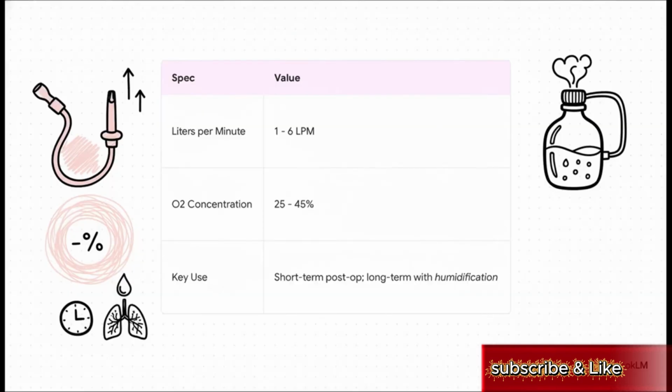Okay, let's talk numbers. A nasal cannula can deliver anywhere from 1 to 6 liters of oxygen per minute. That gives you an O2 concentration of about 25 to 45%. It's a fantastic option for short-term use, like right after surgery. But what if your patient needs it for a while? Well, that dry oxygen can get really rough on their nose. So what do we do? We add some humidification, just a little moisture to make it more comfortable.